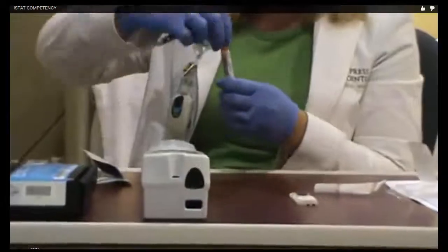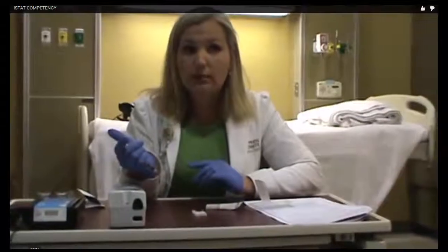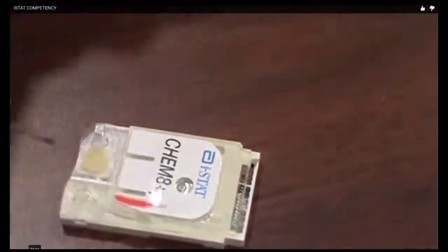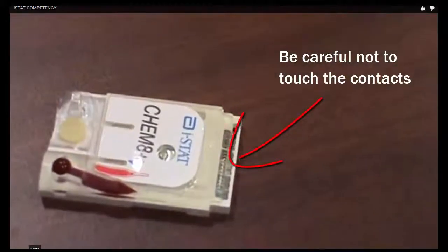This takes a very, very small amount of sample. You want to do a venous stick if it's on the Chem 8. The EG7, you want an arterial stick. Most of the time, it's going to be respiratory therapy who's going to be doing the ABGs. Come in on this one, Rachel. There's a very small hole here. This is where we're actually going to place our specimen. And you'll see it fill up and go into this little area right here. Okay, so that's plenty.